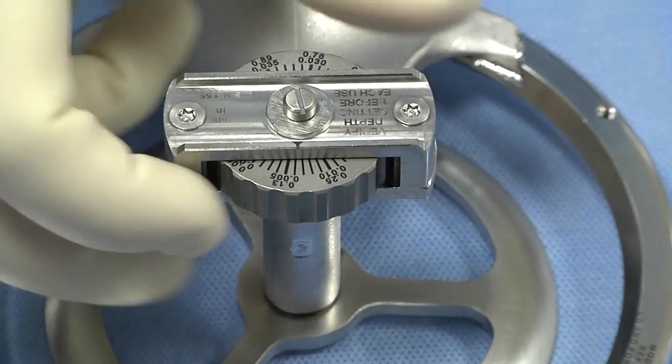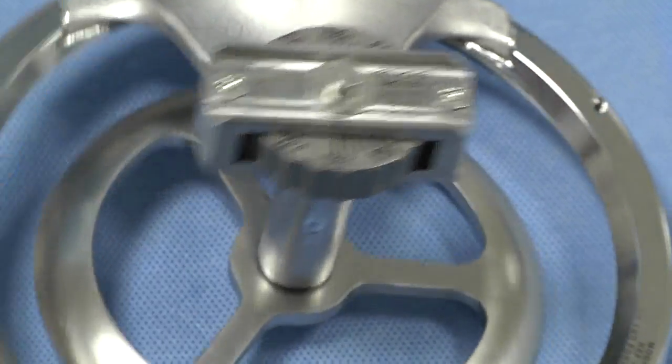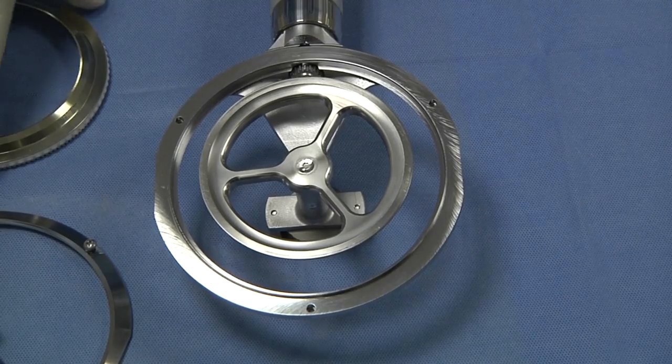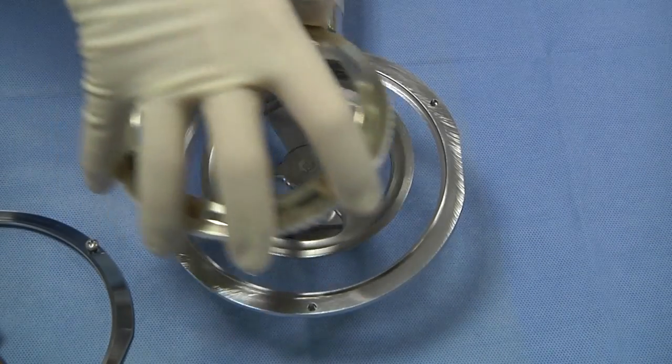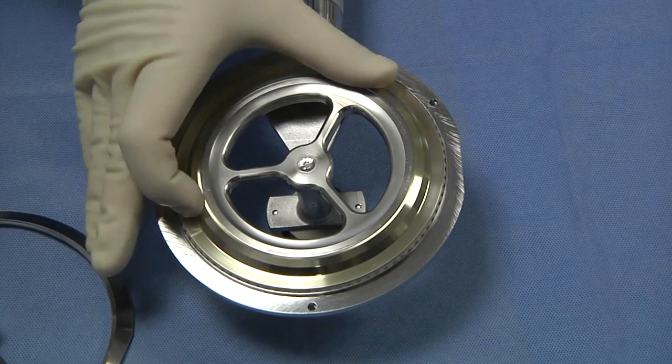Before installing the disposable blade, set the depth gauge to the closed position as shown. Turn the Amalgatome MD lever side down. Place the disposable blade into the housing. Slightly turn the outer edge of the blade to ensure proper seating.